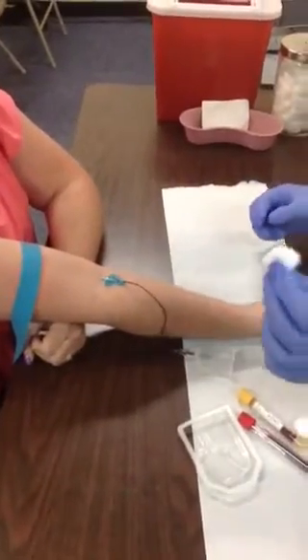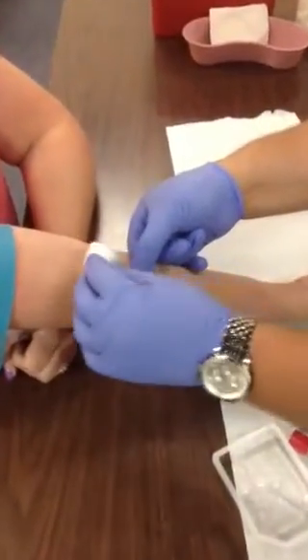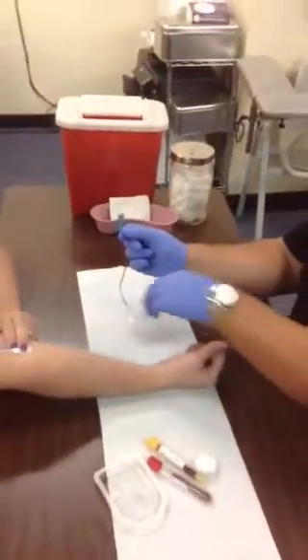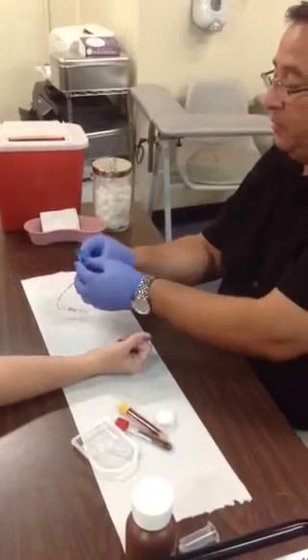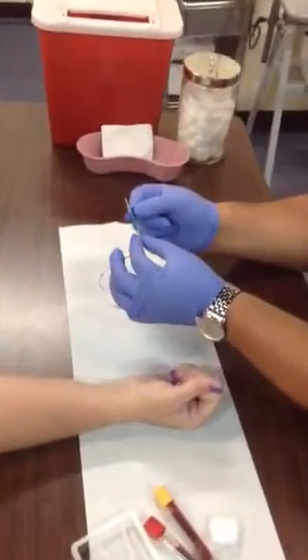At this point, you can set down the adapter, pull your tourniquet, and grab one cotton ball. Pull — you can grab the tail if you'd like — pull the needle out, apply pressure, and then immediately separate hands. With butterflies, you want to make sure your hands are separated from each other because you're going to get stuck with the needle — it usually happens with the butterfly. Take the wings and pull them back together.